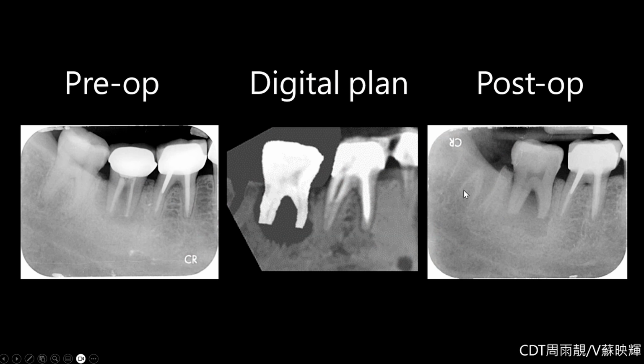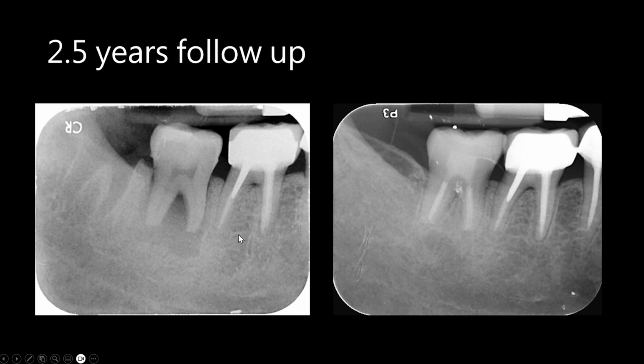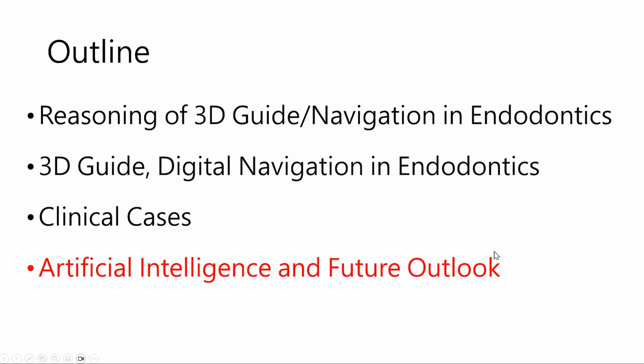And here is the 2.5 years follow-up. As you can see, the lesion is healed, and we put the APEC on it. Okay, so we finished the clinical case. So we're going to go a little bit into artificial intelligence here.